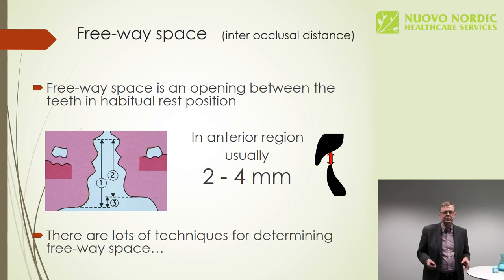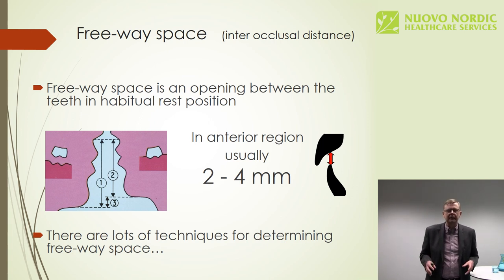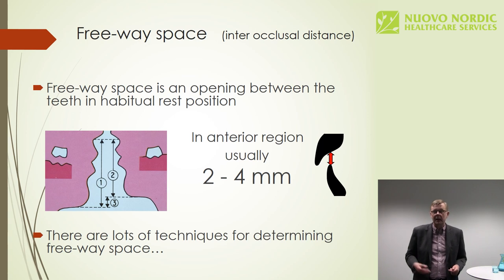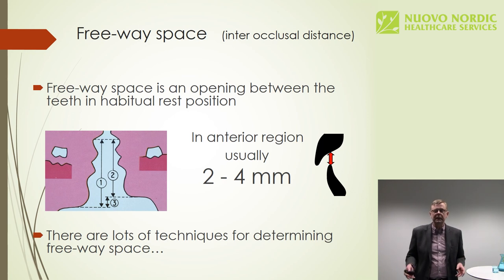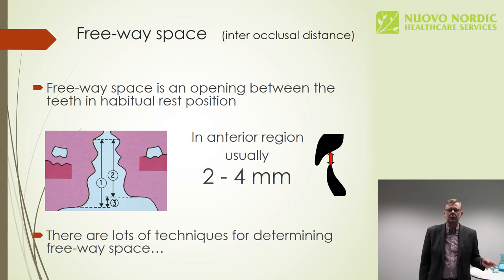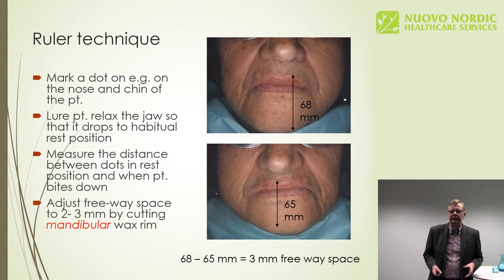The freeway space, as a term, is the space between the front teeth when the patient is relaxed, the lower jaw is hanging, the patient is expressionless. Quite often I tell the patient to imagine a situation where he's watching a bad movie on the TV, and you can just imagine the expression. The lower jaw is hanging, there's a space between the teeth. This is where you want to catch the patient when you determine the freeway space.